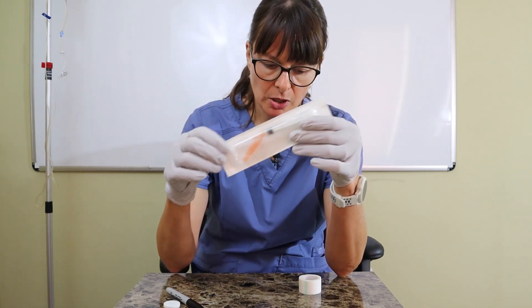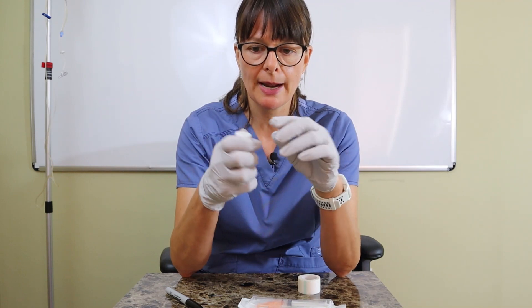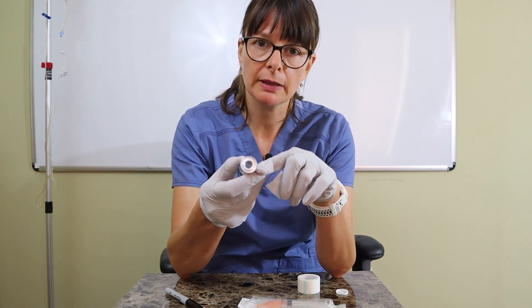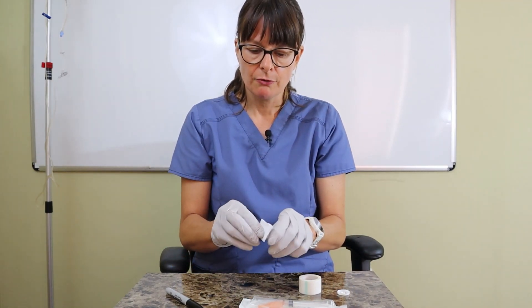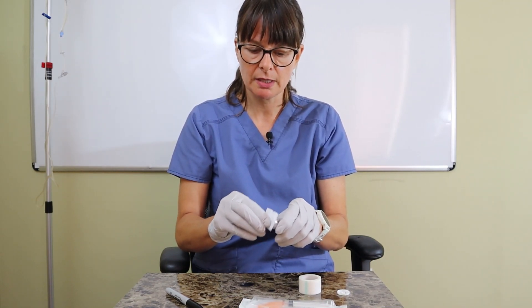Because this vial is still capped, I need to uncap it. Although the cap was on there, it's always best practice to clean the rubber port. You can see there is the metal ring around it and then the rubber port where I'm going to put in my needle. I need to vigorously clean that for about 10 to 15 seconds to make sure I continue using aseptic technique.